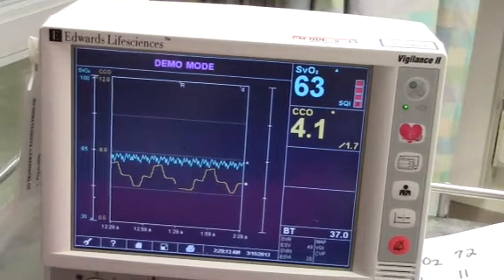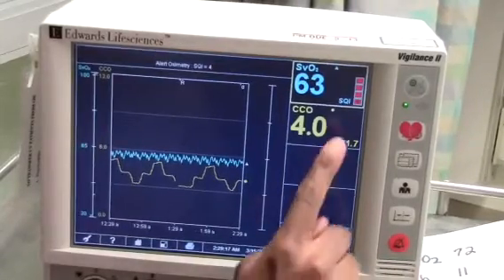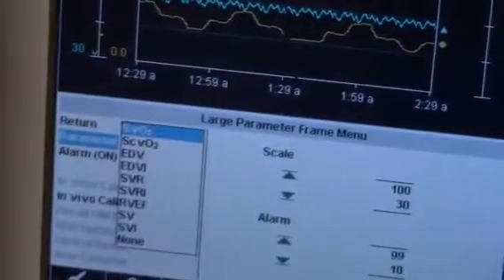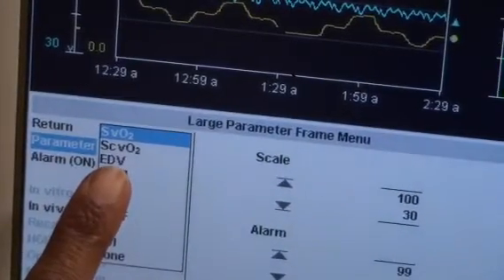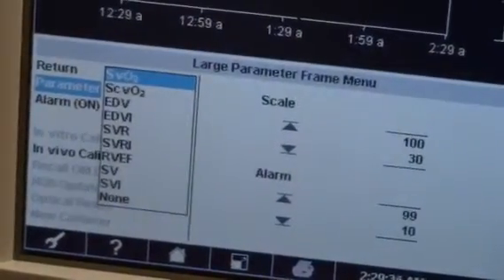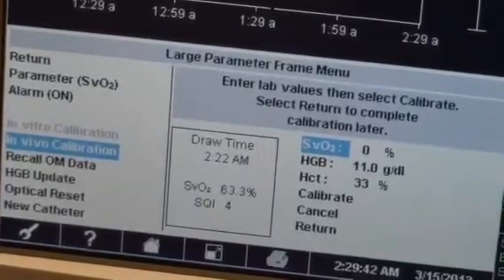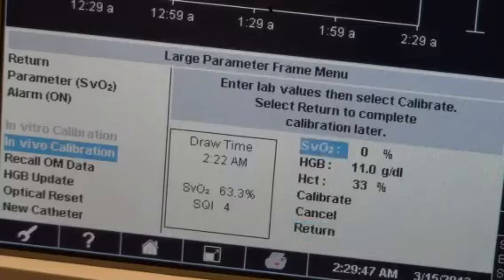To begin, use the navigation knob to highlight the SVO2 or SCVO2 parameter frame. Press to display the menu. Select the parameter option to verify the correct oximetry label — SVO2 or SCVO2 — which is dependent on the type of catheter being used. Use the navigation knob to select and press in vivo calibration. The screen displays a message of in vivo baseline setup in progress, ready in 25 seconds.